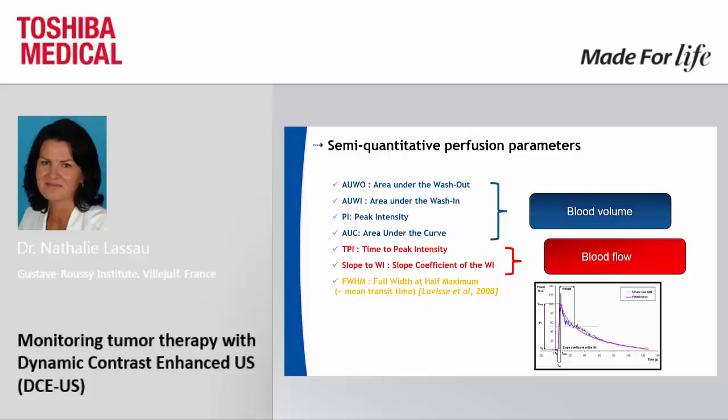If the oncologist asks you to evaluate the blood flow, which perfuses the tumor, you need to calculate the time to peak or the slope during the wash-in. And after, you could also calculate the mean transit time.